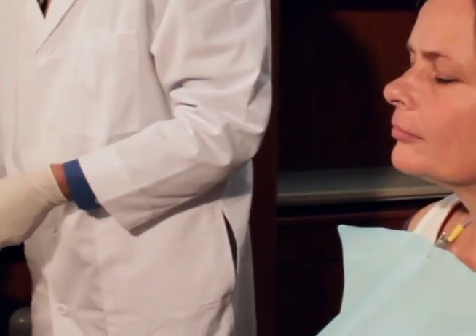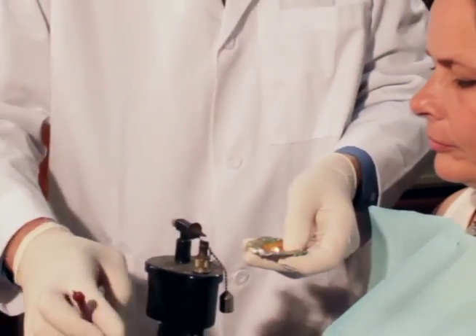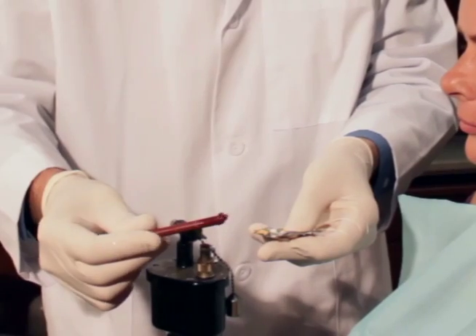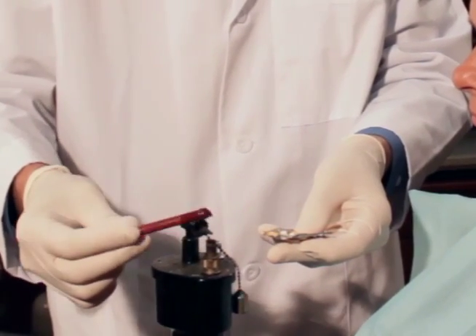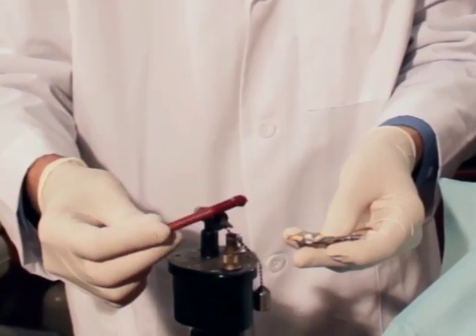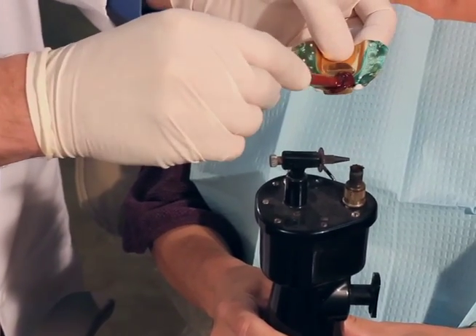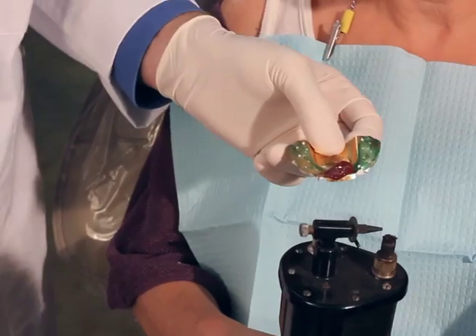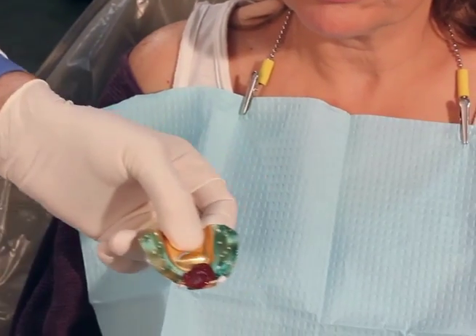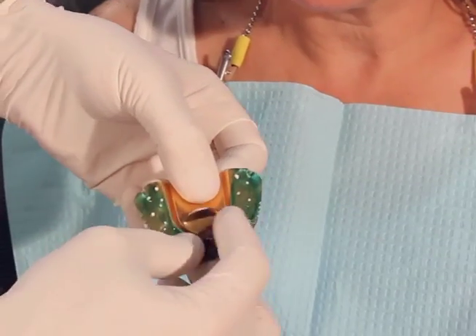Now we can heat some compound for an anterior jig. We're going to heat up a nice big centimeter or so spot of this — get it nice and smoking hot so it'll stick to the tray real good. When it just starts slumping, get it all globbed right there in the front of the tray. Then we can temper this in hot tap water because we don't want to burn the patient. At this point you can even move it around or form it how you want.